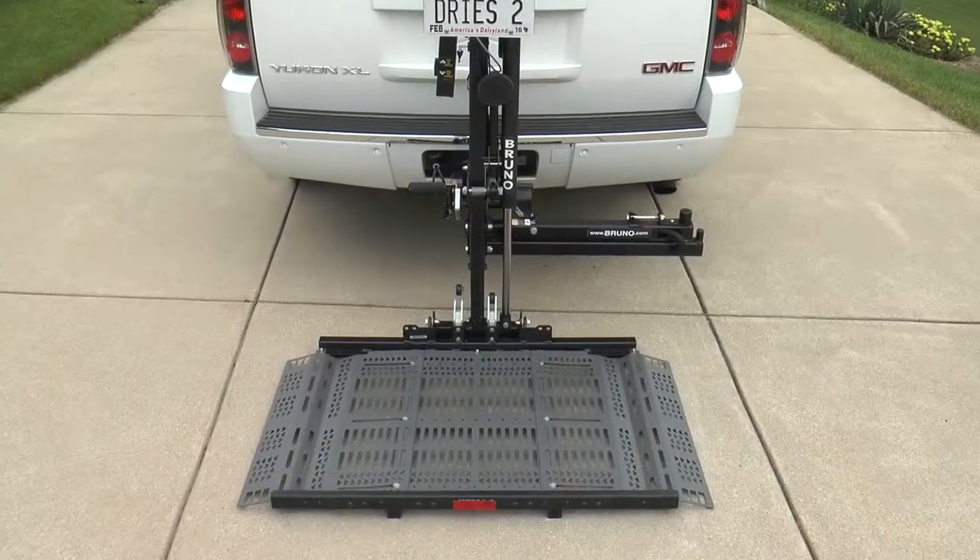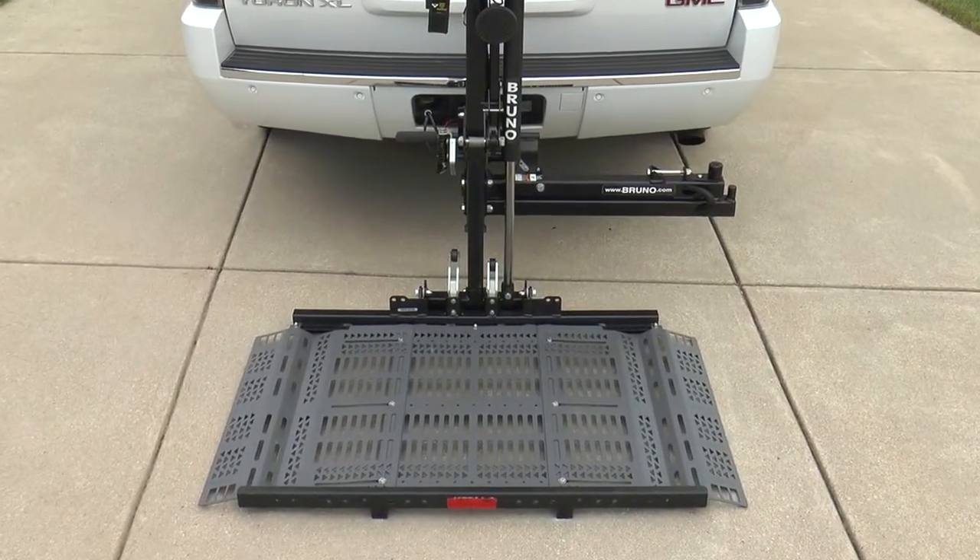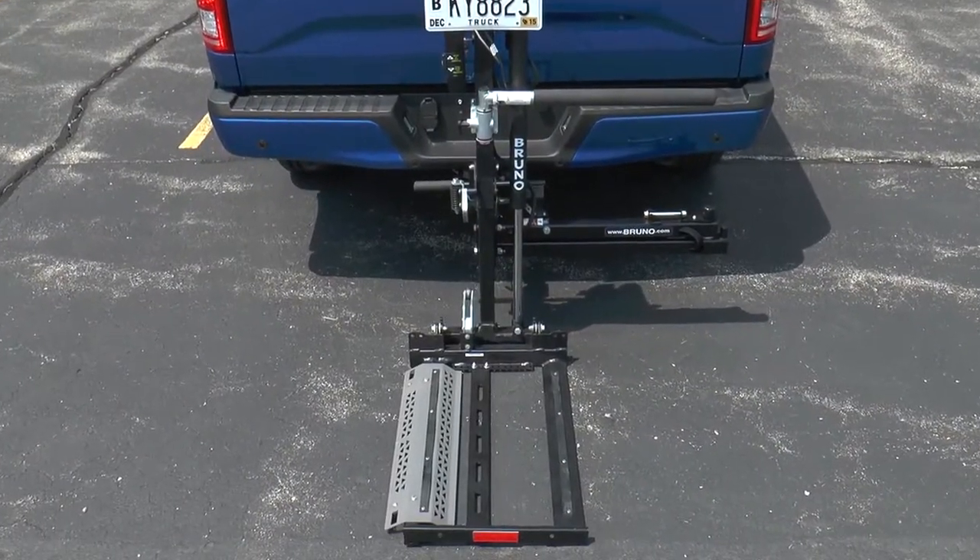Different platform sizes are available to match your mobility device, including versions specifically for scooters and a compact design for mid-wheel drive power chairs.